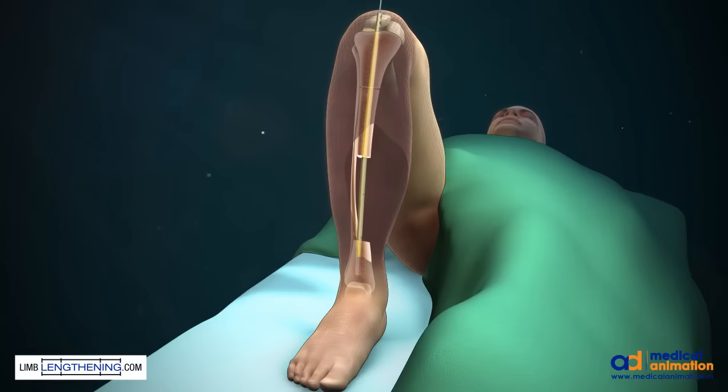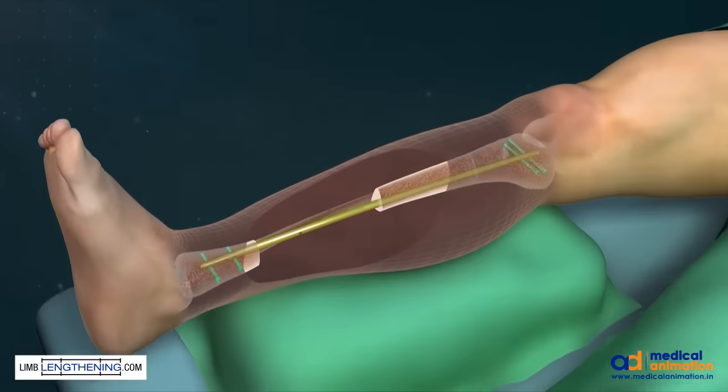Once the osteotomy is completed, the nail is passed into its final position and is locked in a standard fashion. For small periarticular fragments, we recommend three interlocking bolts.